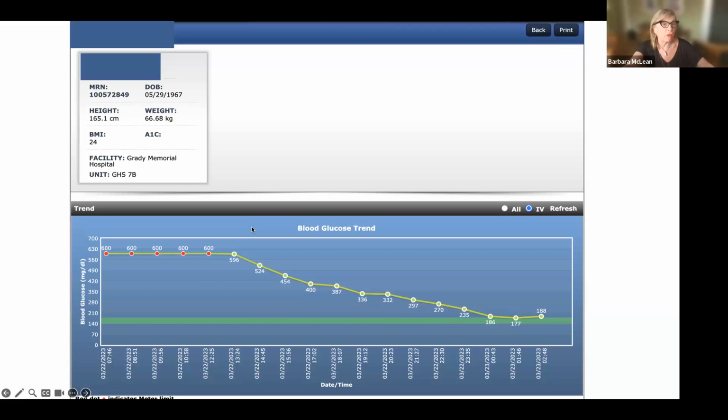Meter min, which is 10 or less, we've never had since we started with Glucommander in 2016. Never had anybody whose blood sugar went below 40. And that is really rare, less than 0.01% of the over 9,000 blood glucoses that we have measured. Less than 0.01% were 40 or less. So that is fantastic when you think about all the different areas that we're using. And thank you all very much for the hard work that you're doing.